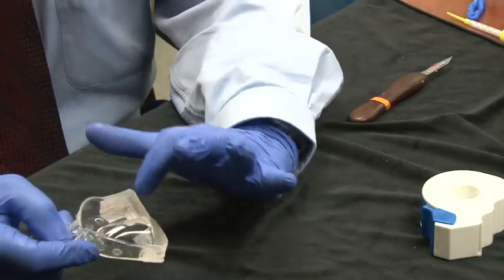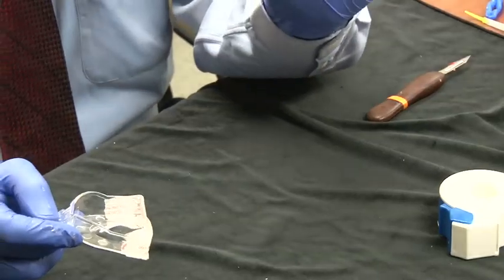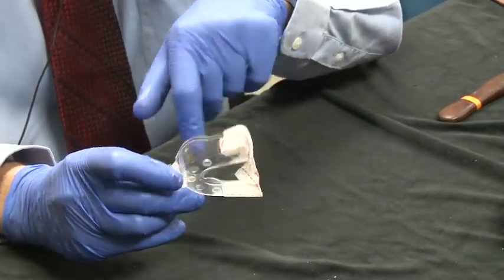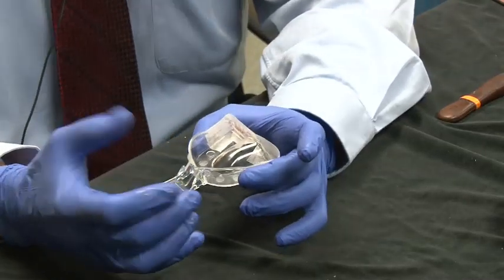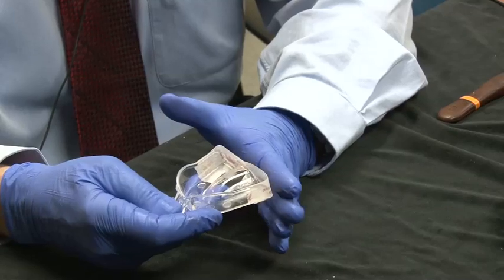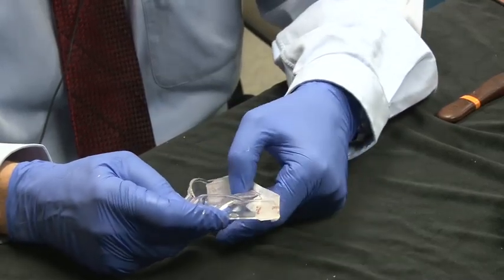And now what's really nice is that you don't have to worry about the wax. This is just an alginate where you might have used the holy tray. So it's got holes in it so that you can get more retention of the material when you take your impression and still get good trapping of the distal, the second molars.